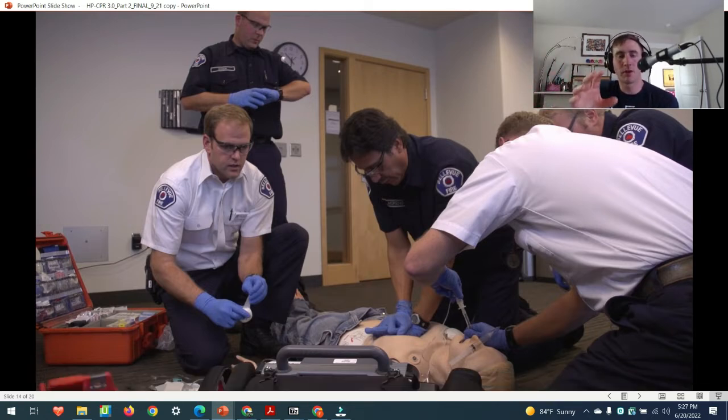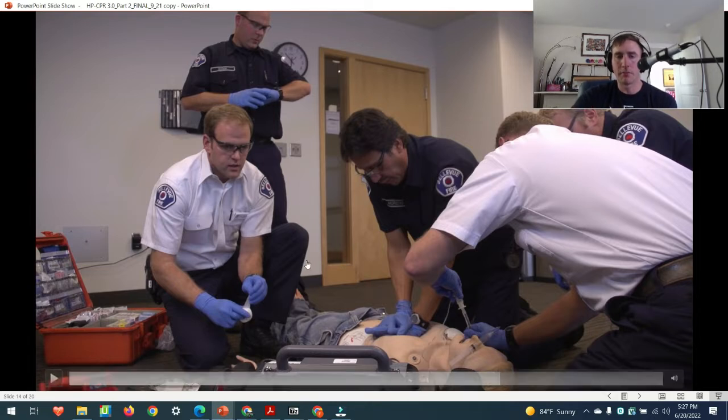For us, it's probably not going to work out the same. All right. Well, preferentially, you would have the paramedic move right in here, start getting the monitor ready, getting the pads out, getting your pads prepped, getting them ready to switch.